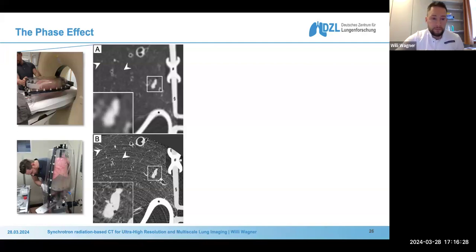And the idea is to scan a patient in the synchrotron scanner. So actually on impulse of Christian Dullin, we just tried what we could do. And in Heidelberg, we have developed a phantom that was actually designed to look at fresh lung in clinical CT scanners and in clinical MRI scanners.